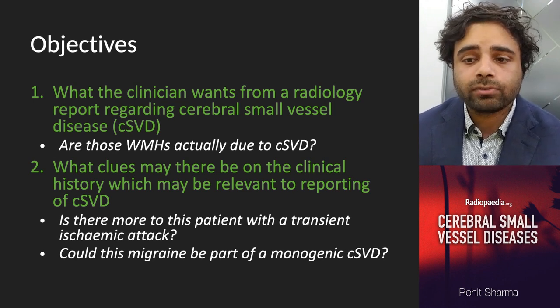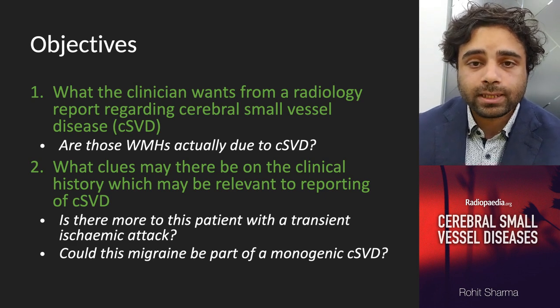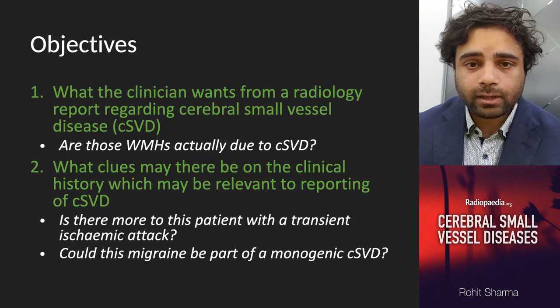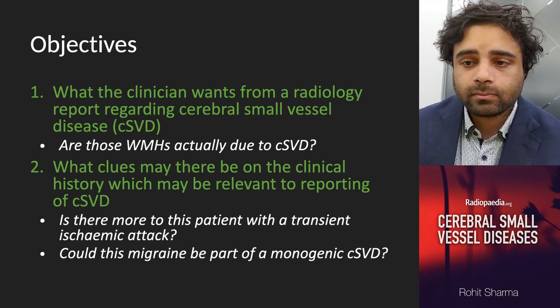which may be relevant to the reporting of cerebral small vessel diseases, in particular focusing on the patient with a clinical history of an apparent transient ischemic attack, and also the patient with a clinical history of migraine, and thinking about monogenic small vessel diseases in this clinical context.